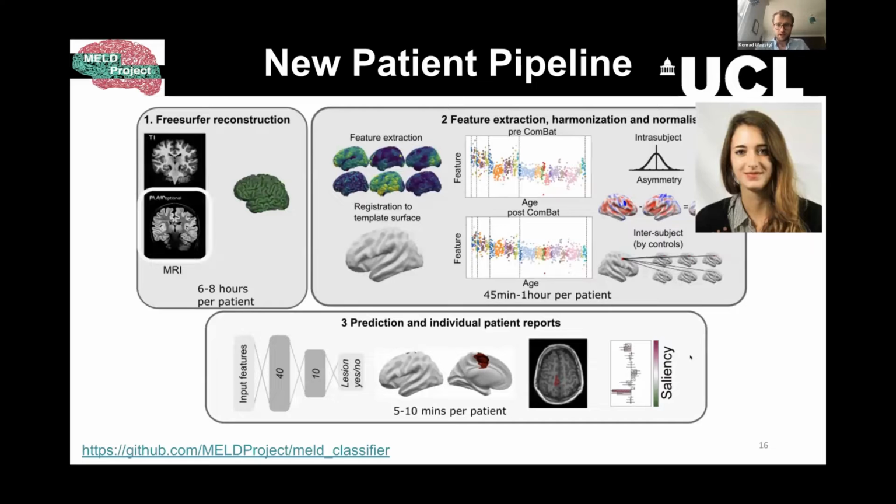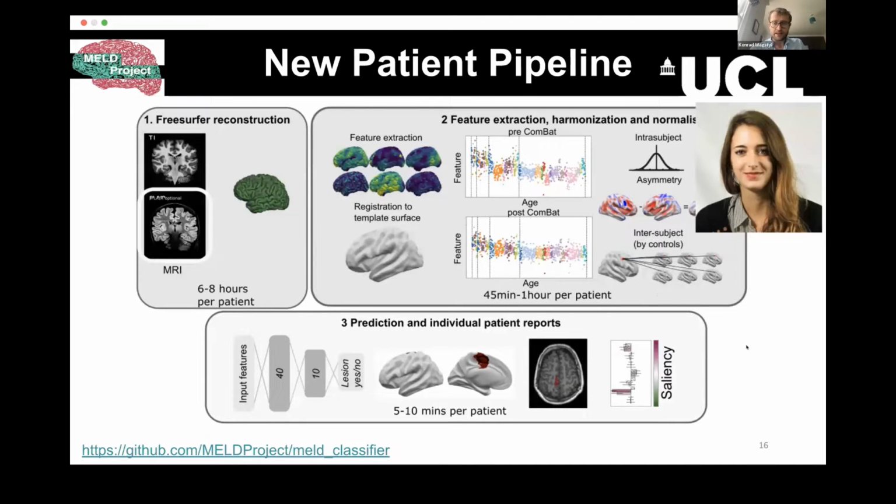And then I'm just gonna introduce Mathilde, who did a lot of the work in wrapping this into a single script that you can then run on new patients. The script is broken down into 3 stages.